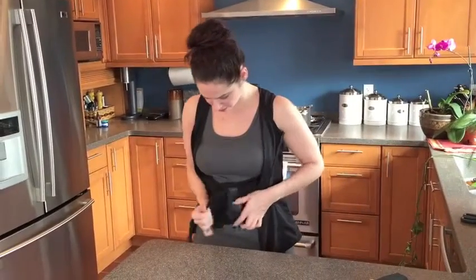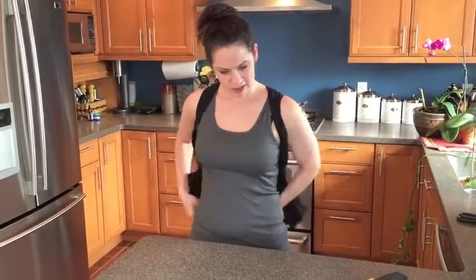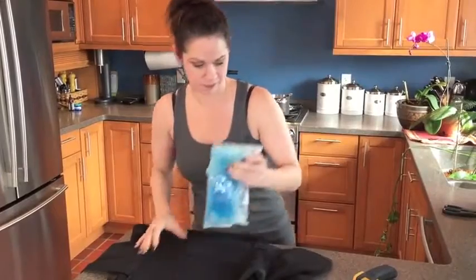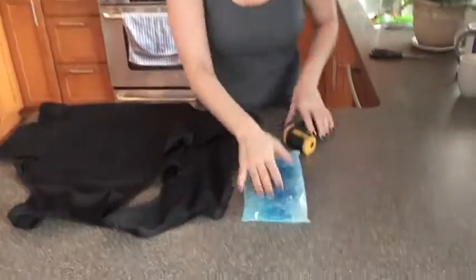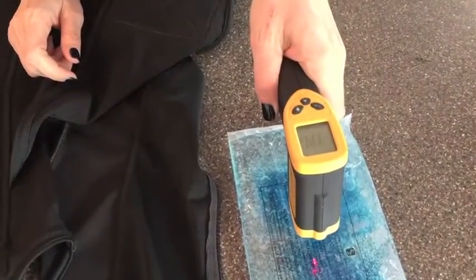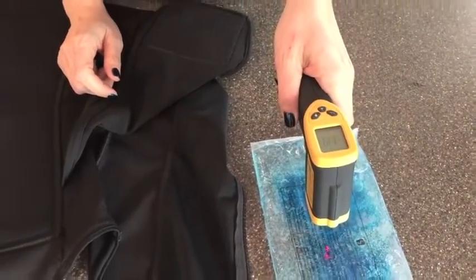But just to show you, I want to take the temperature of this pack. So after an hour we're at 113 to 114 degrees, so you can see that this can last way past an hour.